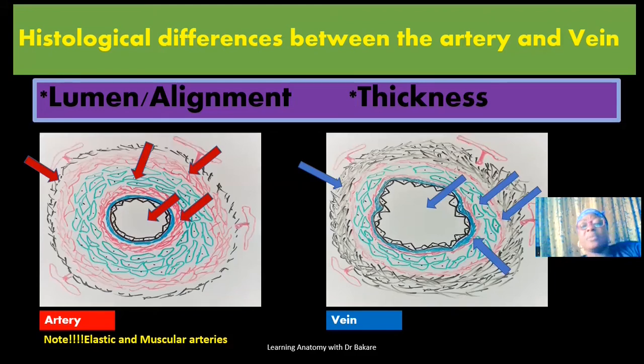And also, if you look at muscular arteries, the muscular arteries are smaller, and they include the femoral artery or the radial artery. These arteries are muscular because the deposit of smooth muscle within the tunica media is more than what is presented in the general configuration of histological presentation of arteries. So that is just the basic difference. When you try to process these arteries into a histological section, you should take note of the thickness of the tunica media. And this you can use to establish or deduce the kind of artery that you have processed.